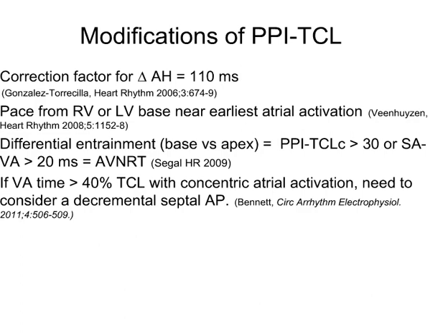very useful. The other thing that you need to realize is that when you have a decremental septal accessory pathway, long post-pacing intervals may fool you. And that's the one case. So short post-pacing intervals, you're good. I've asked Fred Marotti again whether he's seen any since we've done this study. Never seen a short post-pacing interval that turned out to be AV node reentry. But if you get a long one, occasionally it can be due to a septal decremental pathway.